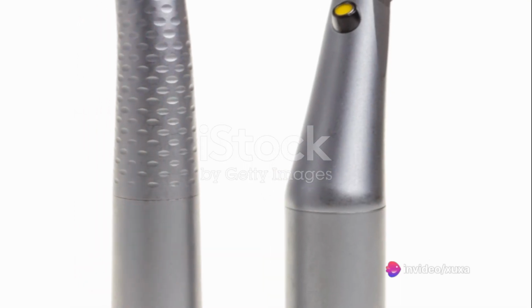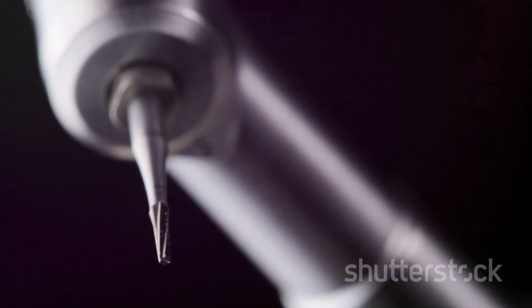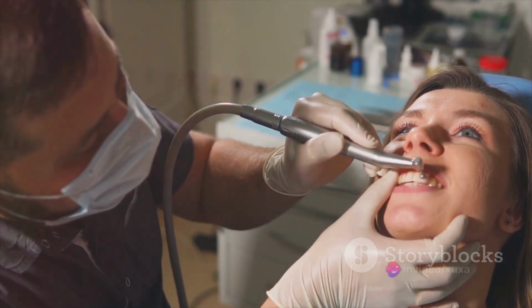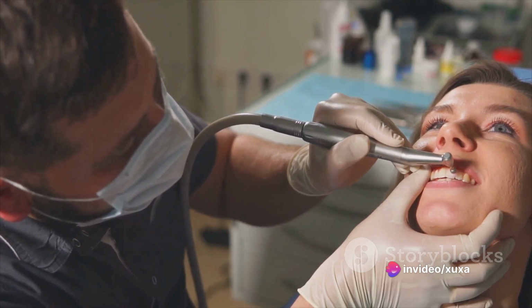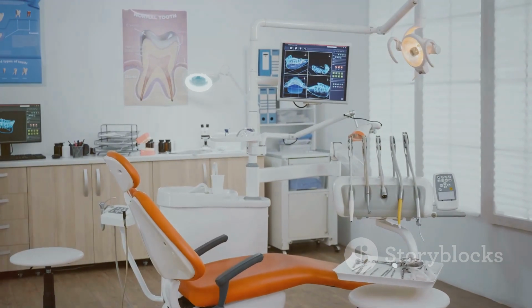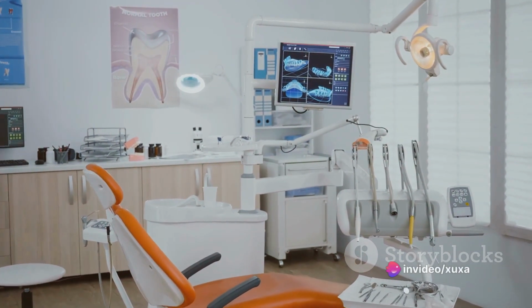Spherical drills and trunk cone diamond drills can be instrumental. For form convenience, diamond or ultrasonic drills can be used to conform to the pulp cavity. Cleaning and antisepsis of the cavity involve removing decayed tissue, bacterial plaque, and antiseptics with sodium hypochlorite solution. Access surgery involves direct access to the cement dentin limit, direct visualization of canal entrances, removal of the pulp chamber's roof, and facilitating the use of instruments and removal of tissue remnants.